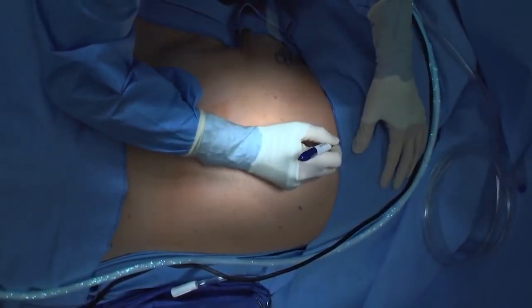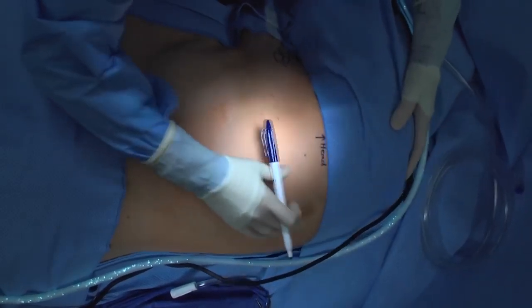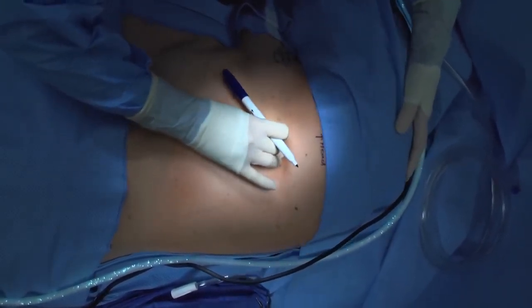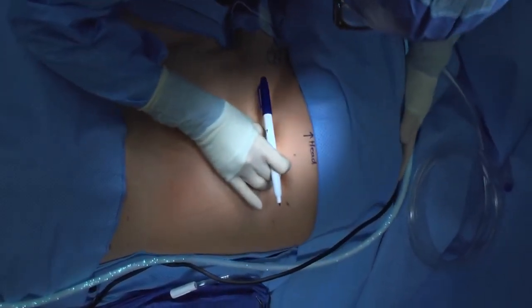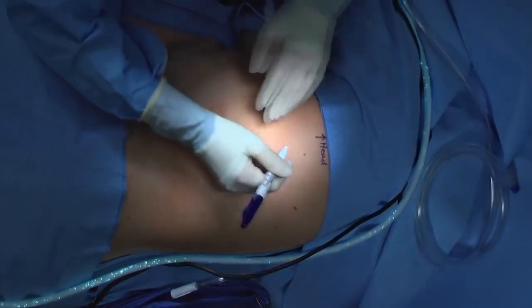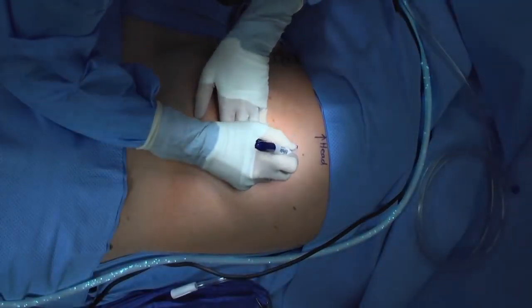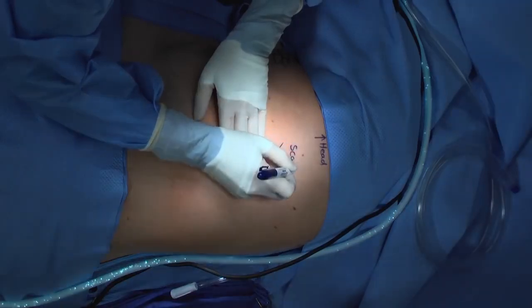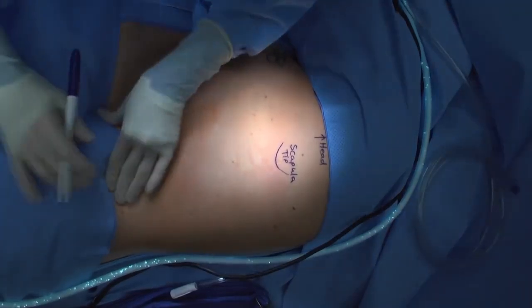We always begin by taking time to identify our landmarks. To help orient, the patient's head is to the right of the screen and her feet are to the left. It is always important to identify your landmarks, even in an emergency situation, because you want the tube to go in quickly and into the right place. This time up front is well spent and saves the time and the effort of a poorly placed tube.